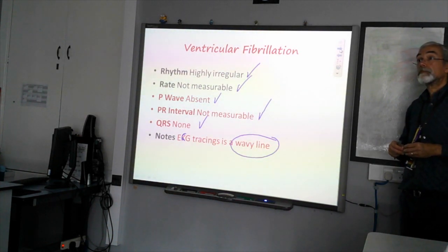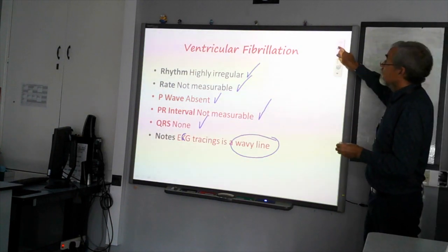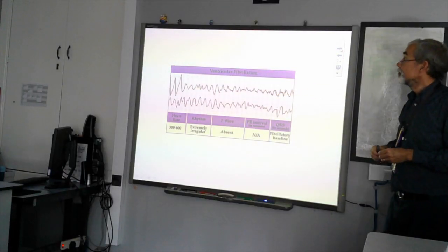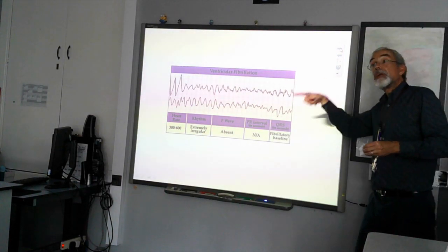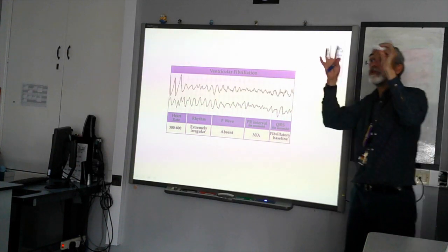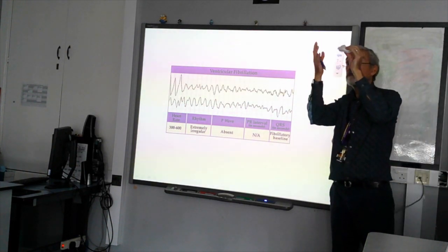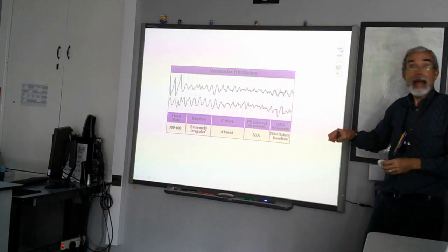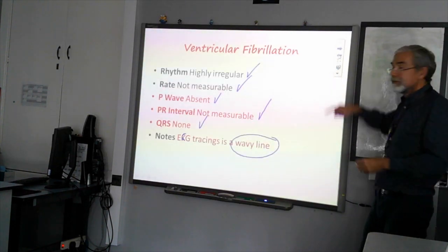So when you say it's a wavy line, what does it look like? I'll come back to this in a second, guys. It looks like that. And that's the last picture that I've given you on the handout. In other words, the heart is literally just quivering. There's no discernible rhythm.